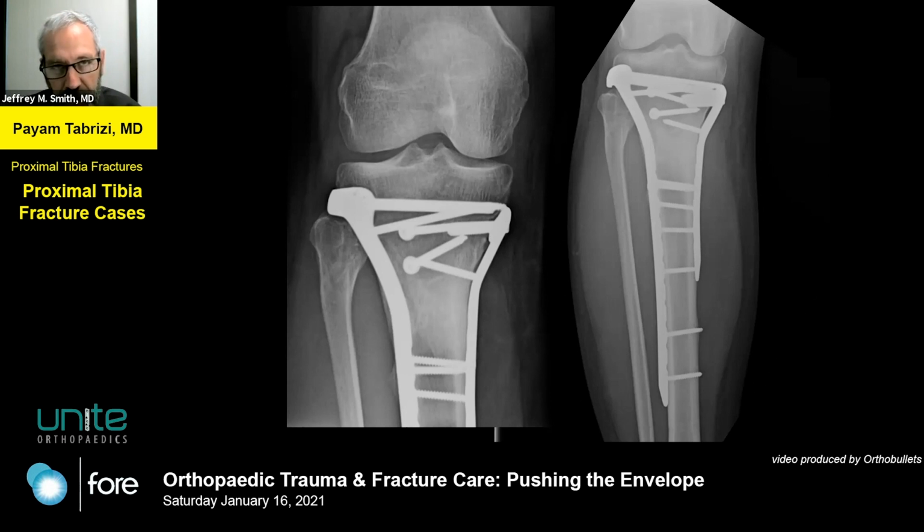So I try to be less critical of what I and others do, because a lot of times we're doing it with pretty good intent, and certainly we learn from those things, but it's sometimes realizing that each case is a little bit different. Maybe once that lateral plate's put on, you look in and say, hey, now that I've done this, I want to go to the medial side and put the plate on right away. Or again, there's a lot of patient factors that you guys have alluded to, where some people are jumping ahead, they've seen certain complications and they want to go straight to a nail. That posterior tibia case of yours and the posterior tibia case of Jeff's, where you guys went right to that because you knew that was going to be an issue. I think those are all super good points on pretty tough cases.